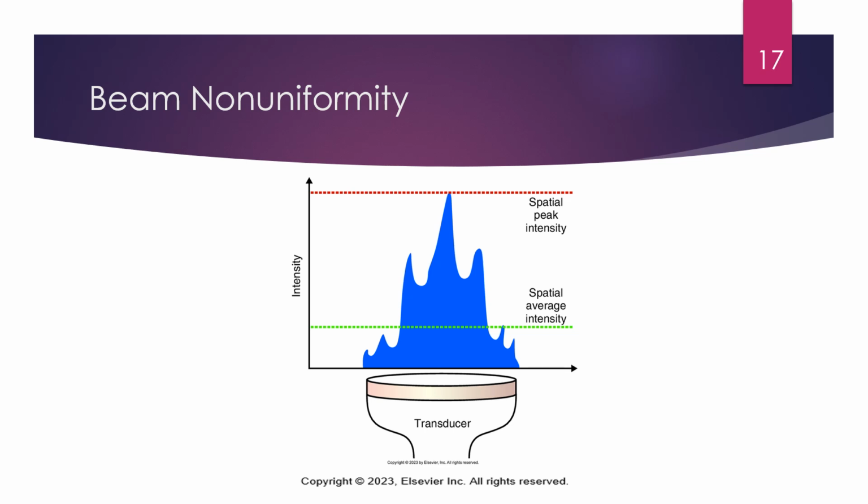And that's pretty much all you need to know about this one. But just knowing, as you can see, the middle of that transducer head is where the most effective sound wave and energy is going to be transmitted. So we want to try to keep that portion of that transducer head pretty consistent over the treatment area. We definitely don't want to sway too far outside of it because you see that intensity really drop when we get closer to the edges of that transducer head. So we want to make sure that the middle of that transducer head is always pointed at the target area.